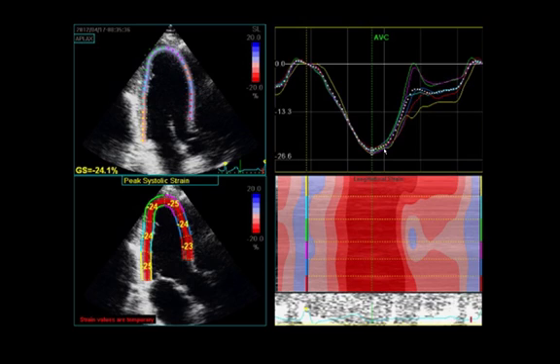But when I see something relating to the mechanical function, the fiber shortening, and it's the machine with a high frame rate that beats my own eye. Frame rate sometimes of 80 frames per second. That's something phenomenal. It's like a very fancy camera that can see things at a slower motion and track it as a slower motion than I can do with the human eye resolution. So I think it beats me, and that's why I like it.